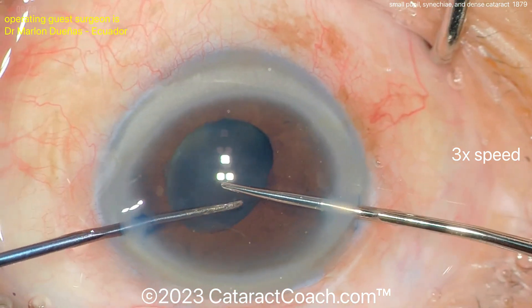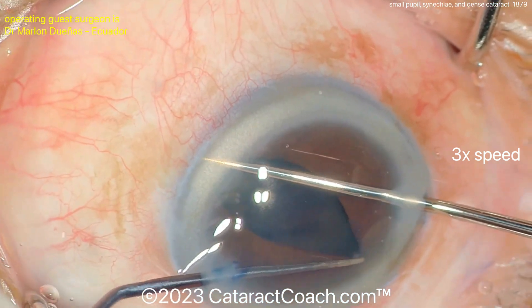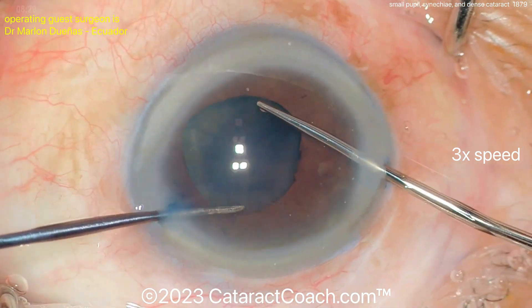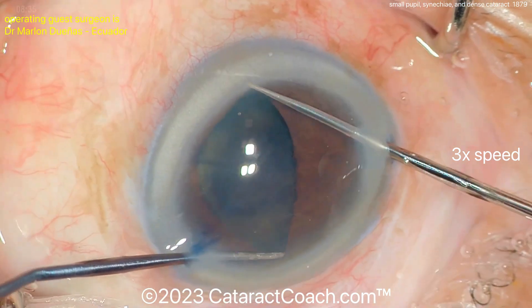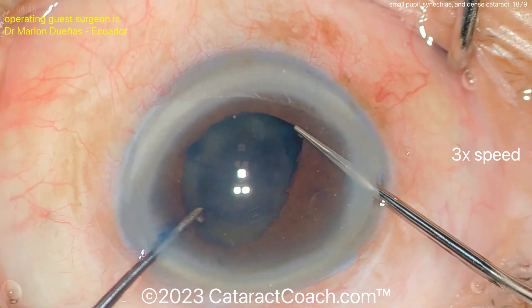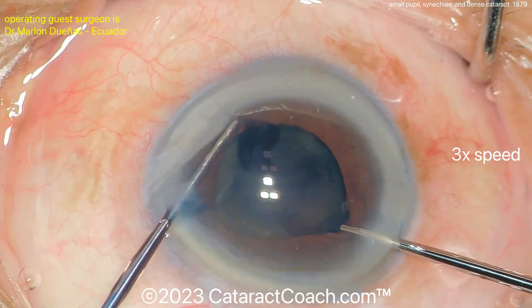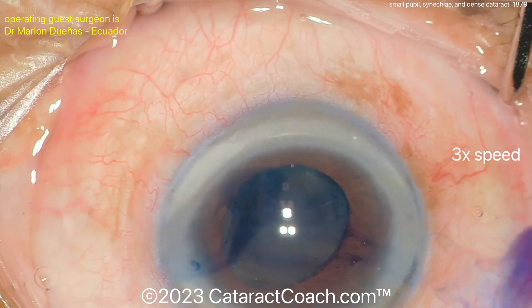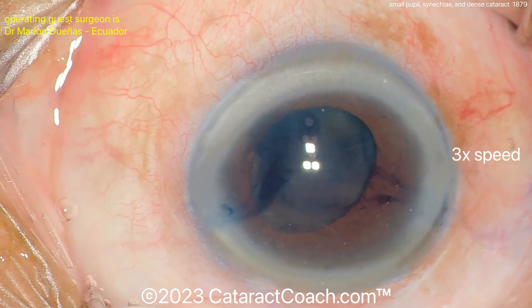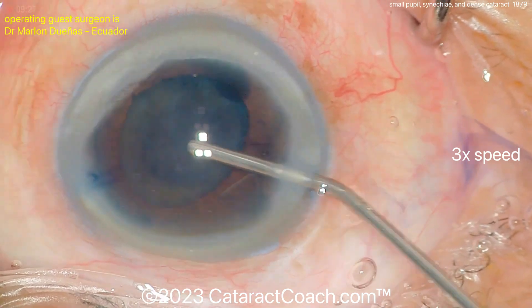Inject a little bit of blue dye under the iris — that helps stain the capsule underneath. Now some pupil stretch: get a good stretch in a couple of meridians, which will cause some micro sphincter tears and help open up that pupil. Then you can use the Osher viscomidrasis technique — using viscoelastic to expand the pupil even more.